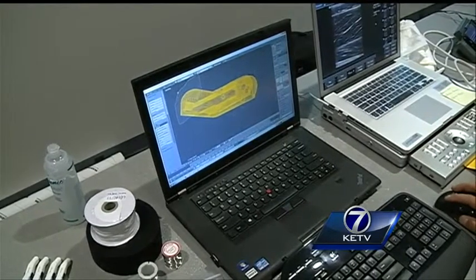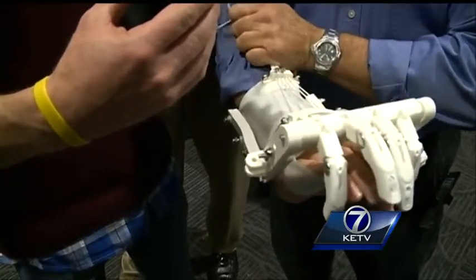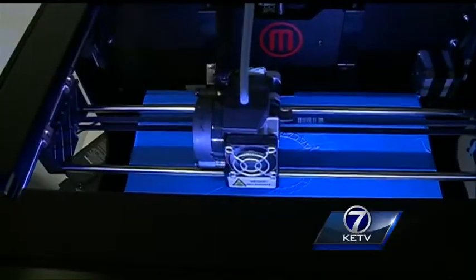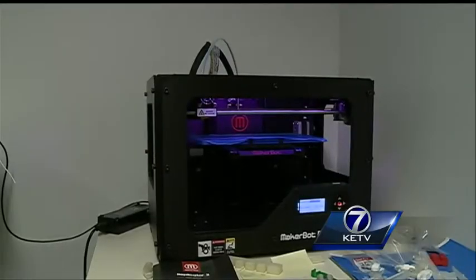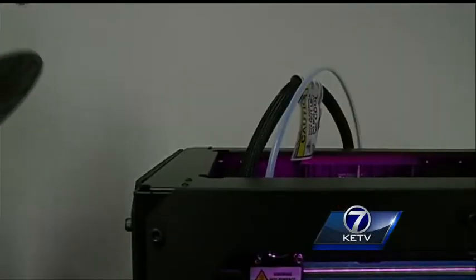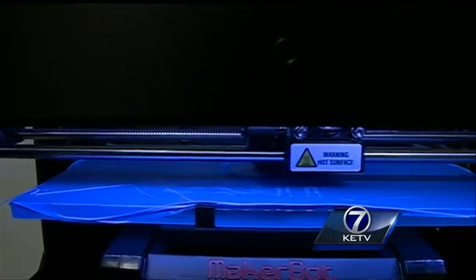Dr. Zuniga uploads 20 pictures of a child's limb, and the software designs the appropriate size and shape to fit his or her body. The file is then uploaded into this MakerBot, a 3D printing machine, and when the plastic heats up and goes through this tube, the machine molds the three-dimensional image.